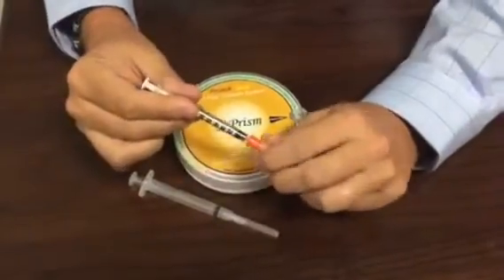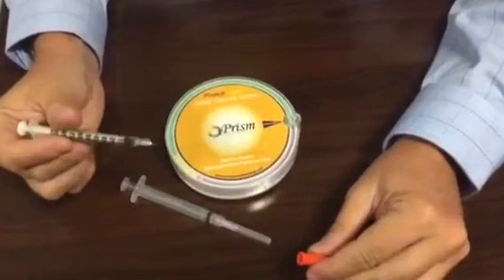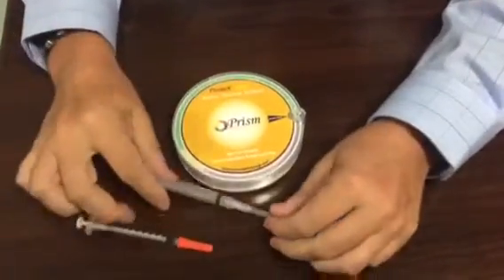And then on the extreme small side, I've got a 5/16 30 gauge needle, used a lot in cosmetic surgery for Botox injections. But we'll start with the 27 gauge here.